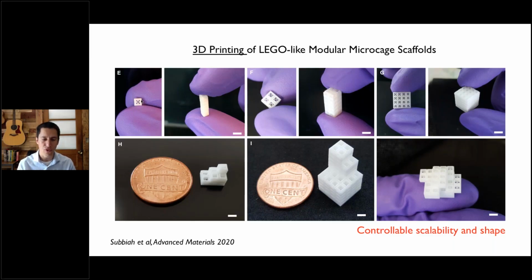And this allows for a variety of different combinations of sizes and geometries and shapes that essentially go as far as imagination can take you. Those are pretty small, but still large enough that they can be stacked manually in the operating room. And the fact that they are hollow, they have this sort of cage-like structure.